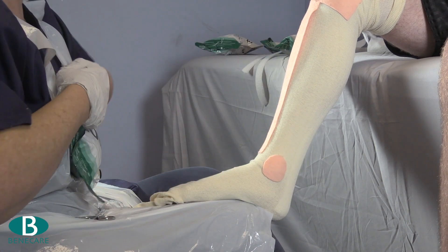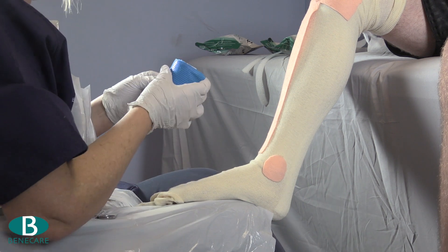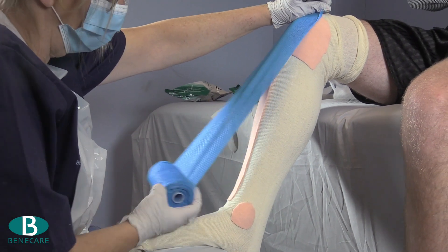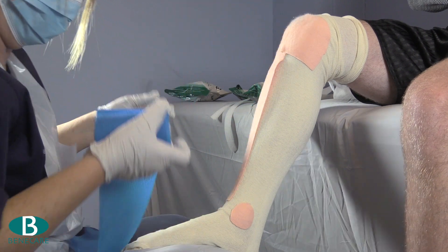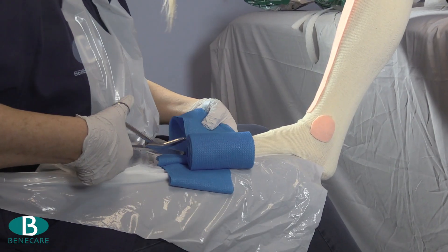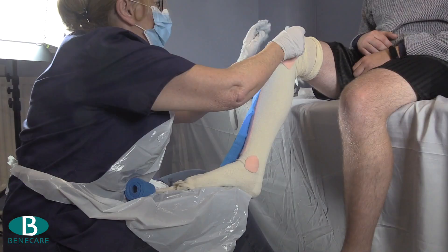Using the BennyCast Advance 10cm, make a two-layer slab to fit from the mid patella to the base of the toes. Cut off the slab and then dip both the slab and the bandage into room temperature water with a moderate squeeze.